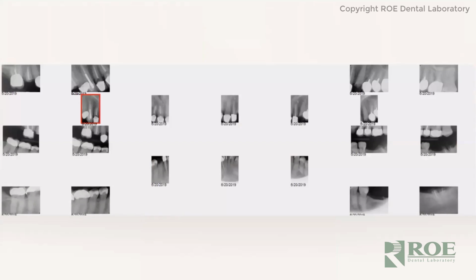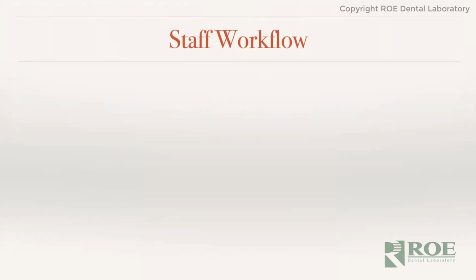Again, we're taking a look at our FMX here and deciding that this is a wonderful case for a Chrome natural, because we don't want to remove bone in a situation like this. Obviously, there are plenty of situations where the patient is deficient in bone, where the removal of bone is minimal, and an all-on-X case is going to work out to our advantage.